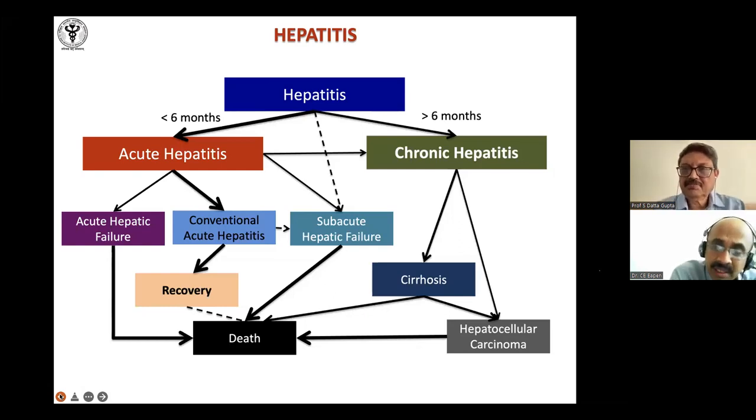Here's a question from Dr. Jayanti, especially in non-cirrhotic portal hypertension, like NCPF, NCIPH. In transjugular liver biopsy, can one reach the portal tracts? You see, in transjugular liver biopsies, even when earlier institutions were doing them, they were not very good. Now the biopsies that we get are fairly good, through experience and other things. And we do get a lot of portal tracts. But naturally, in a core biopsy, you tend to get better biopsies than this.